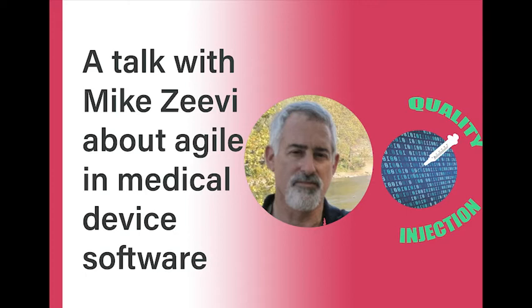Now, the CDRH basically relates today to 3 levels of concern, which means how much injury can you do to the patient or user: minor, moderate, or major. The basic premise here is you have to develop the software, regardless of your level of concern, in a proper manner. This is detailed in the FDA's principles of software validation.